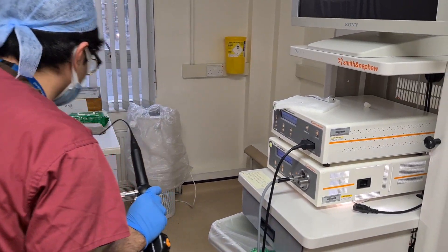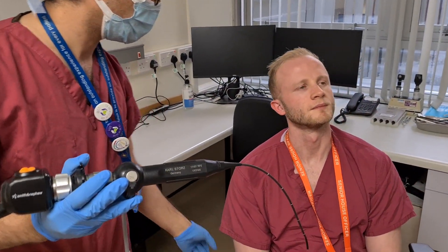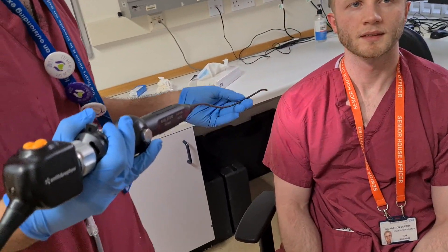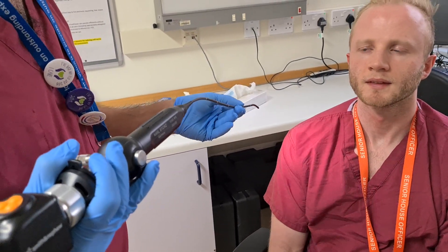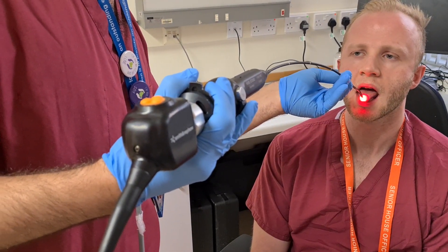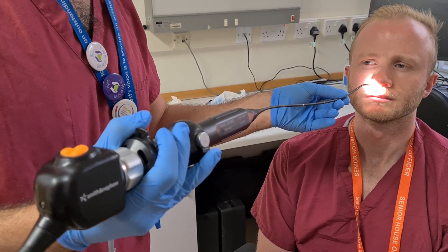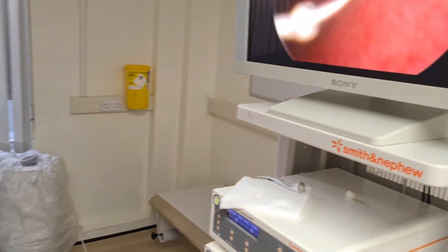What I'd like you to do is keep your neck still, look straight ahead, and bring your head down a little bit. Have a look at the screen — you can see the anatomy there. Nice deep breaths in. The more you breathe through your nose, the easier it is for me, because the air allows me to go in a little bit easier. If you stick your tongue out, I'm going to warm up the tip of my scope so it doesn't steam too much as we look inside. And don't forget to ask me to stop if it becomes uncomfortable.